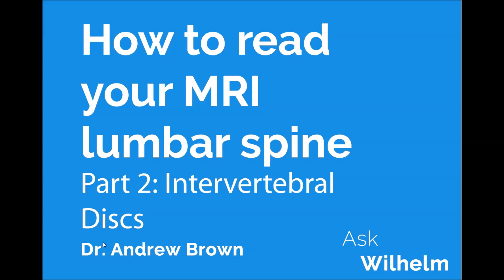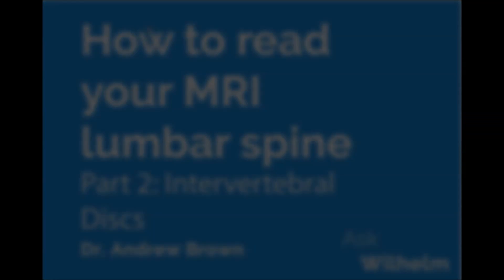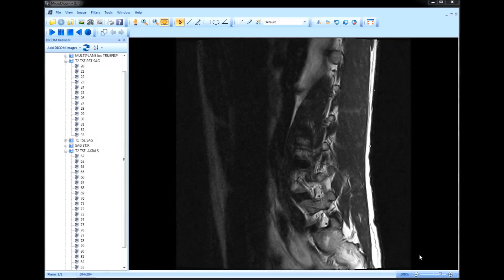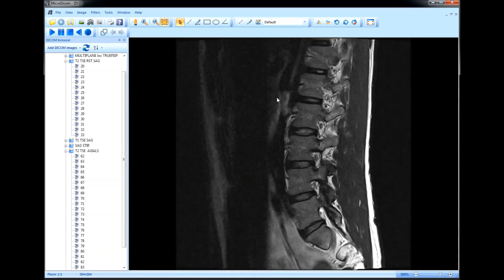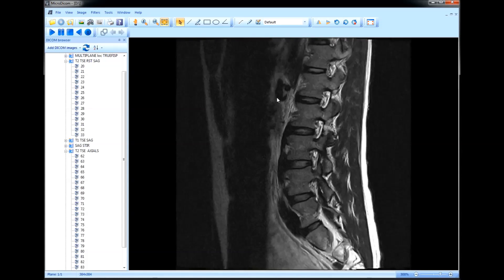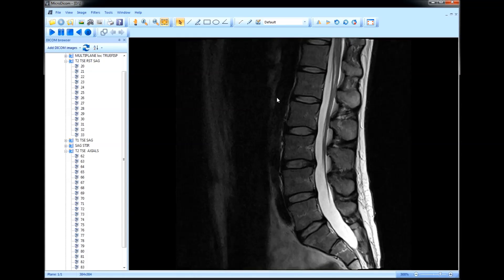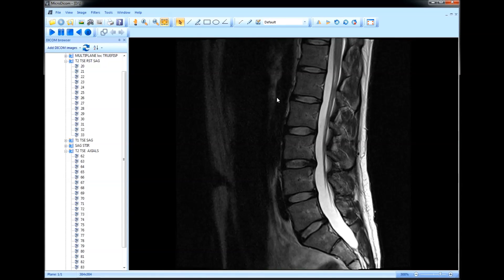In this video, we'll discuss intervertebral discs, their anatomy, and some problems that can arise. We're going to come back to our micro DICOM viewer. If you've forgotten how to load your CD into the micro DICOM viewer, you can go back to our first video for an introduction.